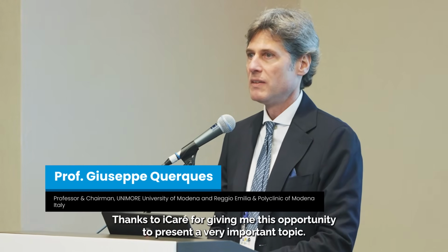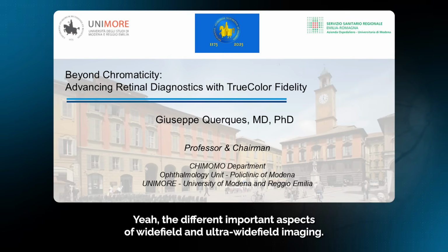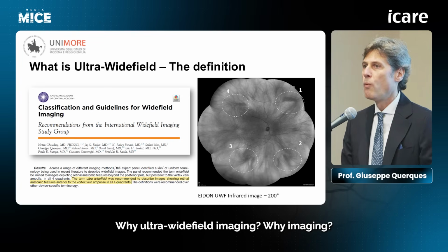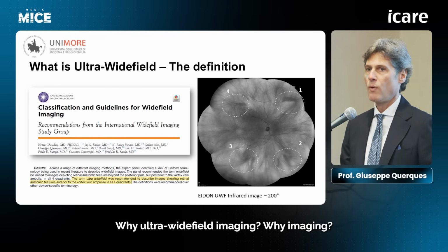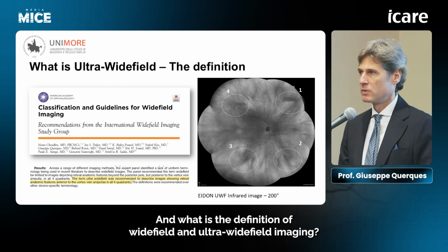iCare for giving me this opportunity to present a very important topic: the different important aspects of wide field and ultra-wide field imaging. Why ultra-wide field imaging? And what is the definition of wide field and ultra-wide field imaging?